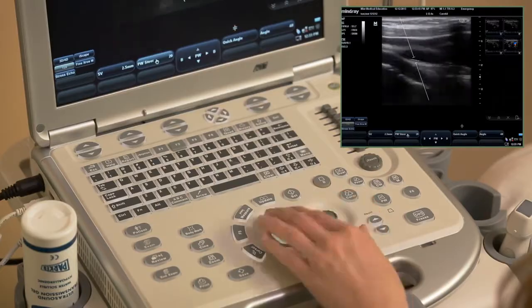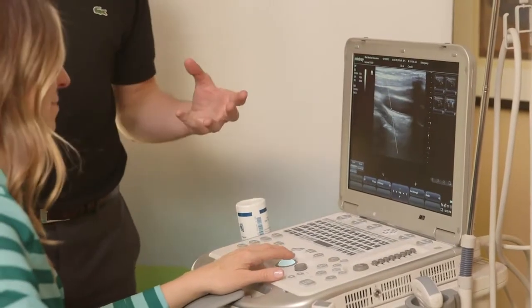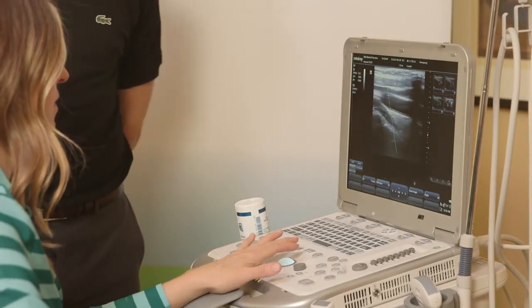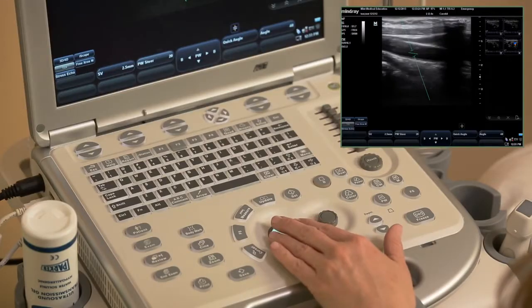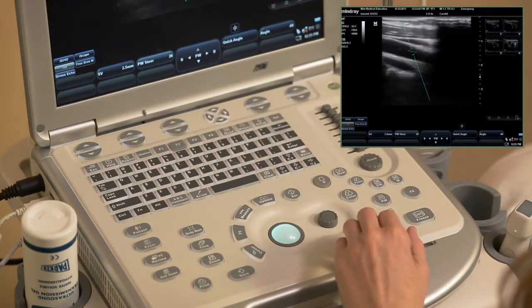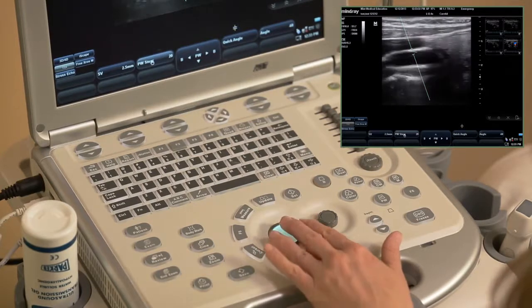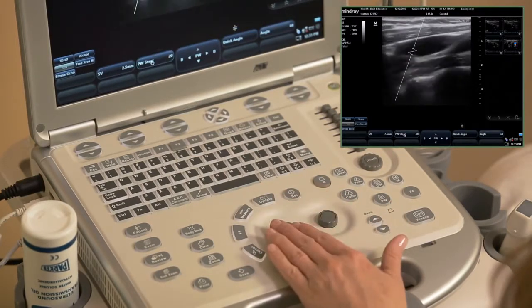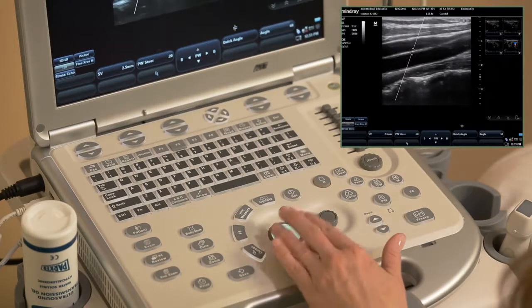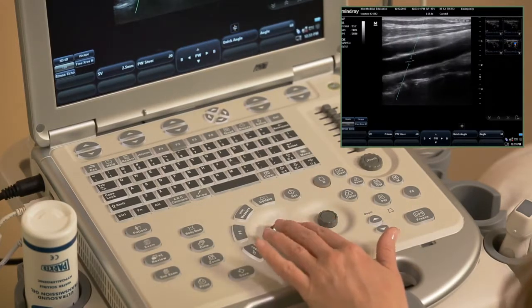You can see that now that this is white, you're manipulating it, but it's not active. So then I would have to go back to the green, active pulse wave Doppler. Exactly. I'm going to steer it back. Sounds like a good plan. Because this is the way it's moving. I'm going to get out and hit the set key again. Cursor. Yep, you got it.